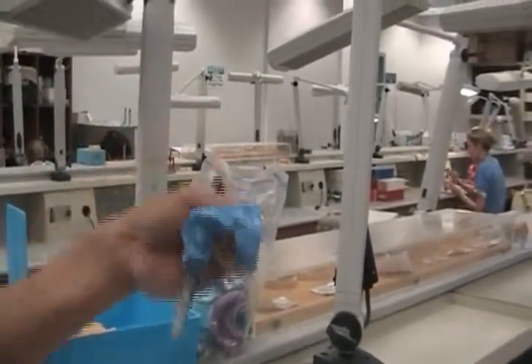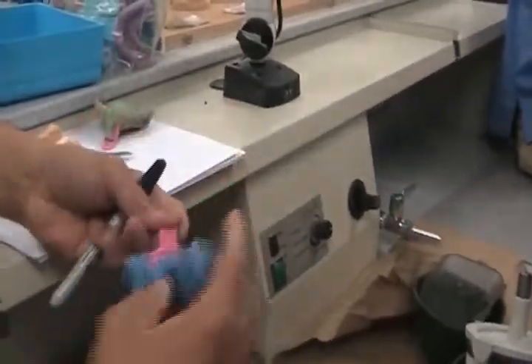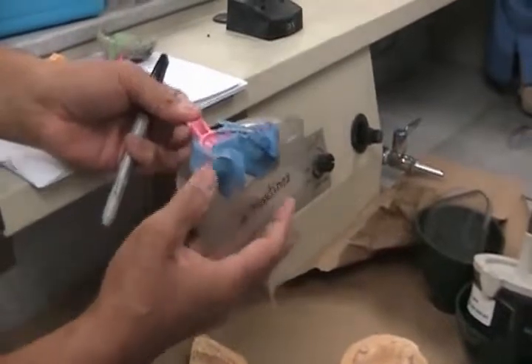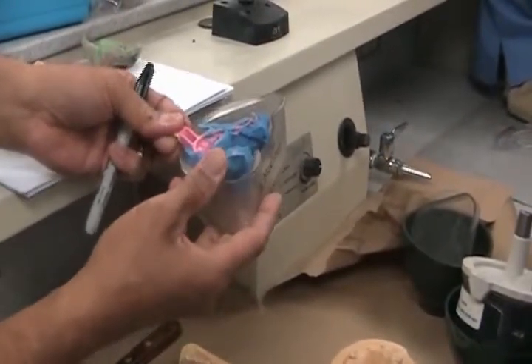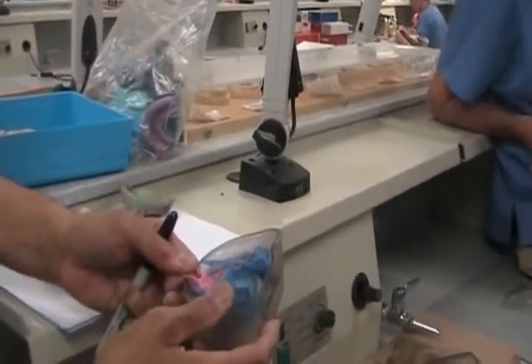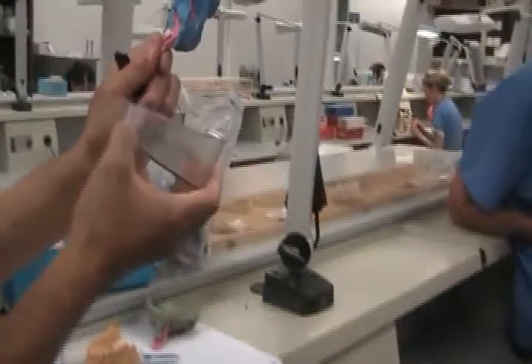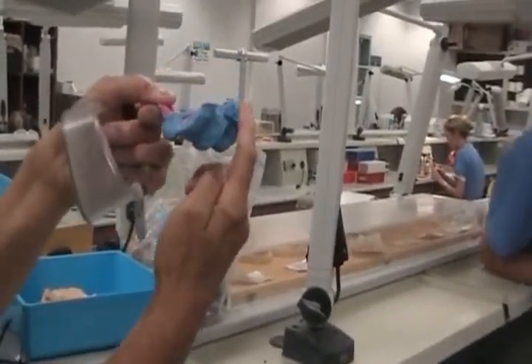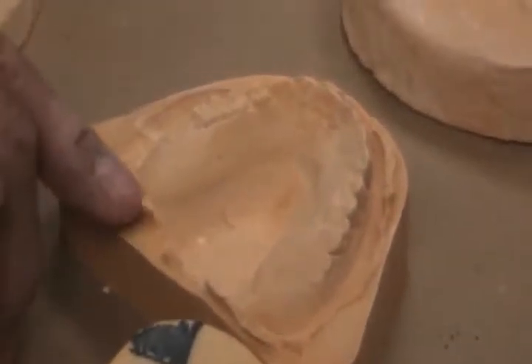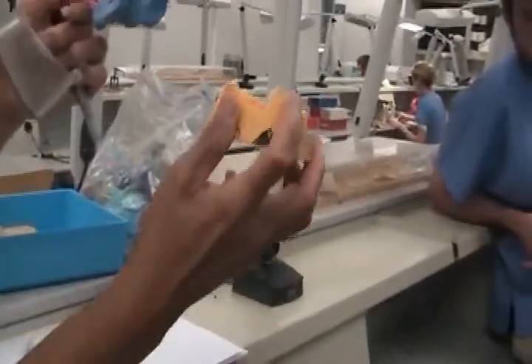Let's say you have an edentulous case and you go ahead and pour it. You see how it catches — sometimes you can't go in there too low, or this could sink down. Because your stone can only reach so far, what happens to the edges is they become very thin and very shallow in the back — unsupported. What I normally want to see when the impression is done is an extended one-fourth inch of stone distal to the retromolar pads and hamular notches.